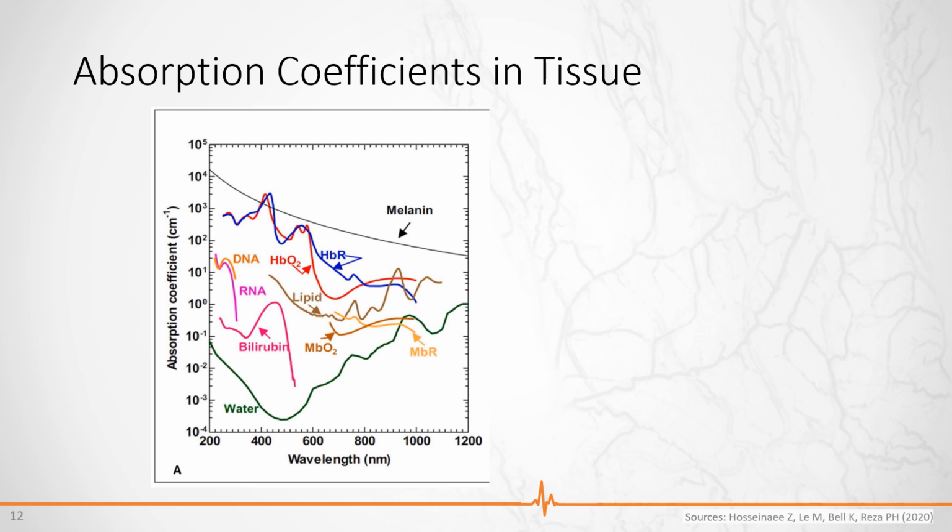One can also identify potential obstacles in the imaging. Melanin and water pose a problem. Due to the high melanin concentration in the skin, it directly already absorbs a lot of light before even the interesting imaging part starts, which also limits the strength of the laser, since the melanin will heat up much more than the tissue below.